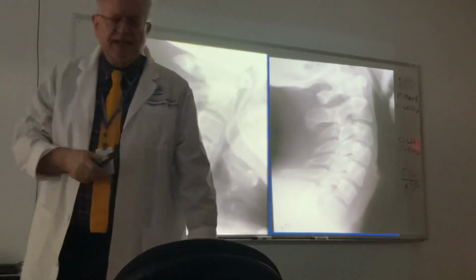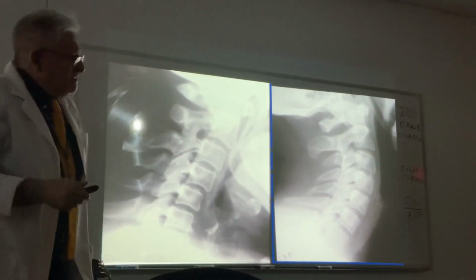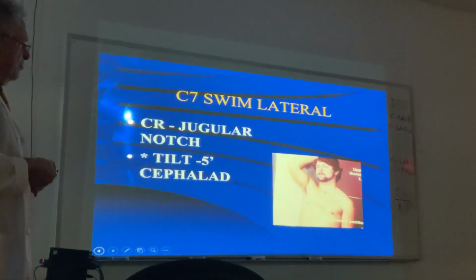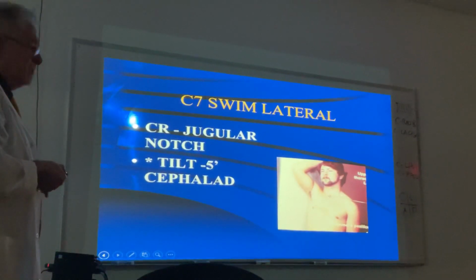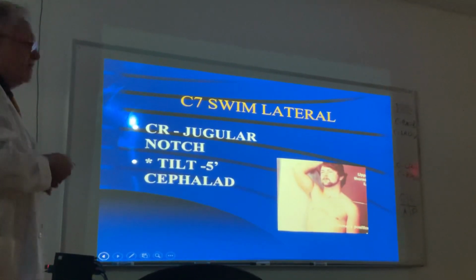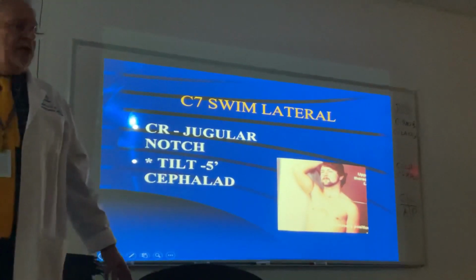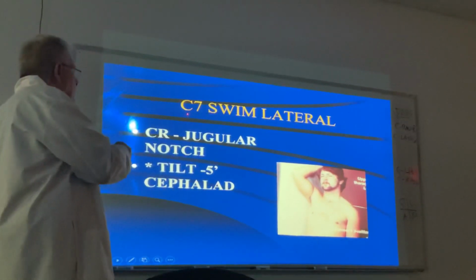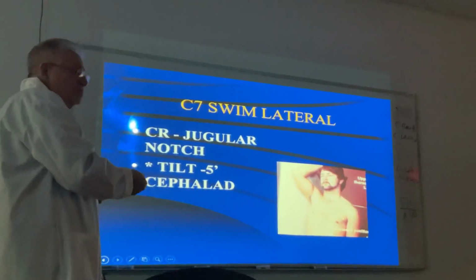Those of you that are contemplating staying in South Florida, you're going to have this all the time because we just have a lot of car accidents, okay? And then this is just a positioning. I don't need you to know how to do it. I just need you to realize if they have a big trap muscle like Damon would have, we have to have a special view because we're not going to see your C7 cervical vertebrae, even though you pull your shoulders back. This is a special view designed to see this vertebral body level, and it happens to be called this because this reminded somebody of a swimming position.